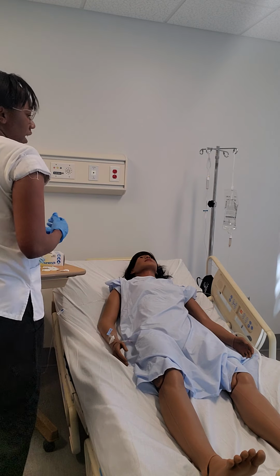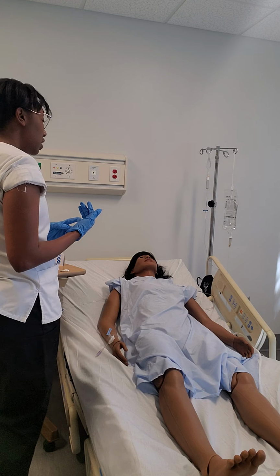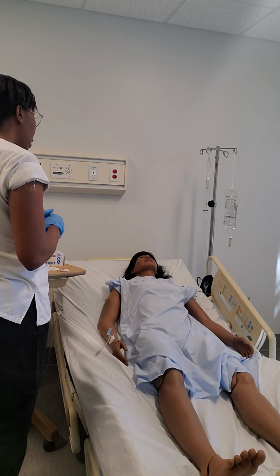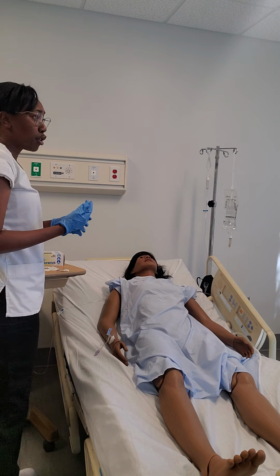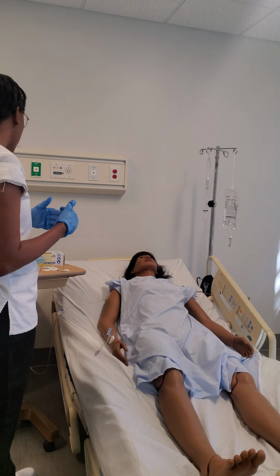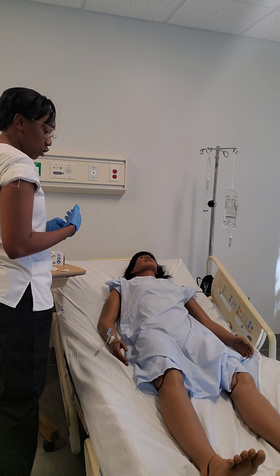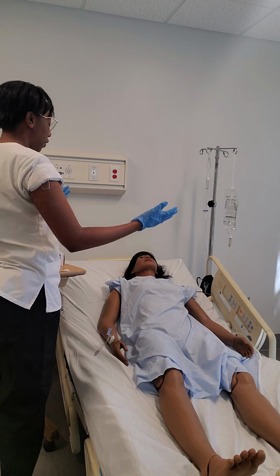So once that medication has been administered, what I would do is I would check the blood pressure again. I should see a decrease. That's how I know that the medication has worked. As far as this medication, there were no compatibility issues that I saw when I looked at the Orange Pharmacology book. But the blood pressure has been checked again to make sure that the therapeutic effect is reflecting.